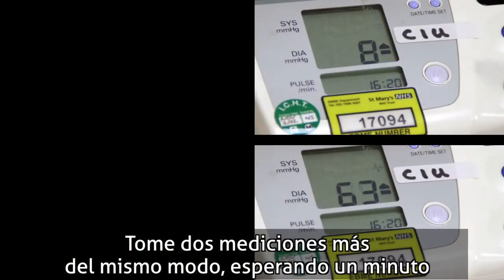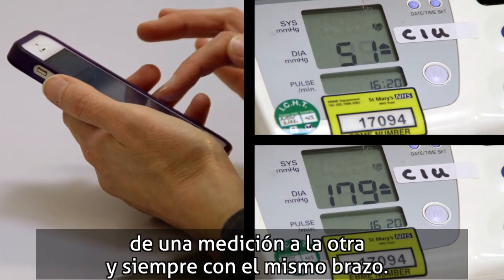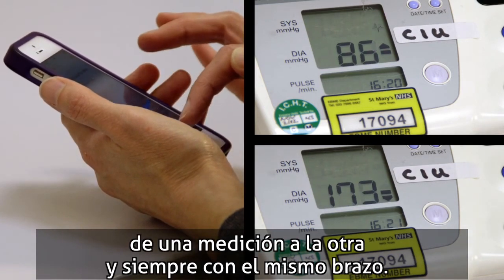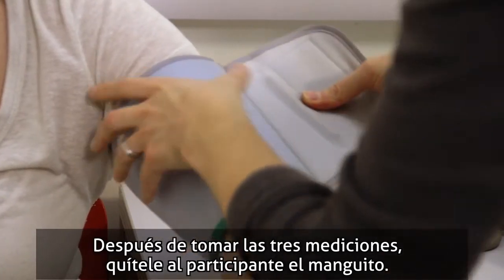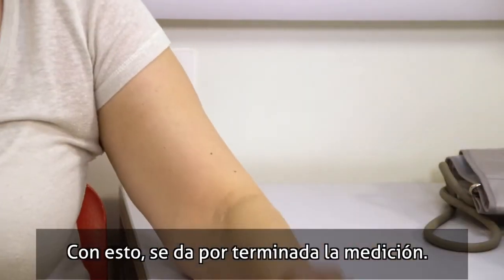Take another two measurements in the same way, leaving a one minute interval in between each reading and recording the measurements with the same arm. After taking three readings in total, remove the cuff and the blood pressure test is complete.